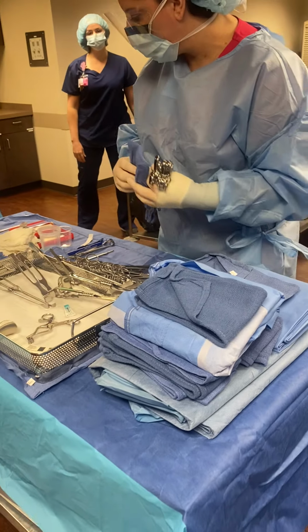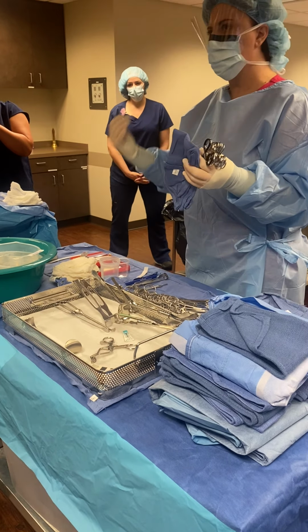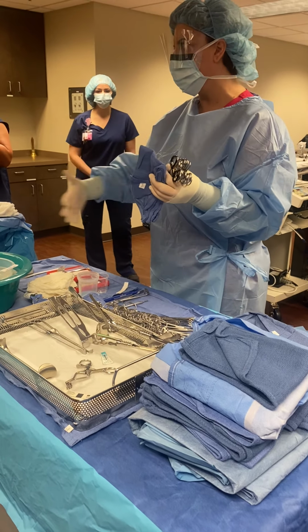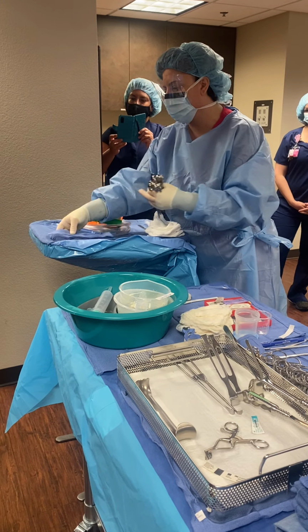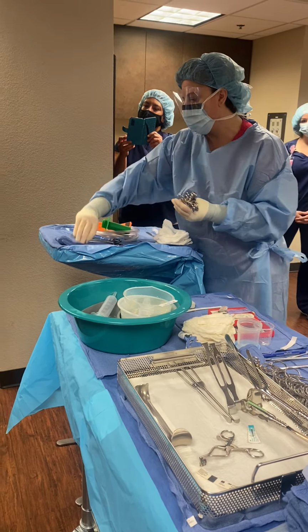So again, there's several ways. You can keep your sutures loaded back here. I was just raised in small community hospitals and surgery centers where it was usually me and the surgeon, so I have a tendency to put more up on my mayo stand. What I do with my sutures is put them on the opposite side. I put a towel up here and I'm going to load them here in a second.